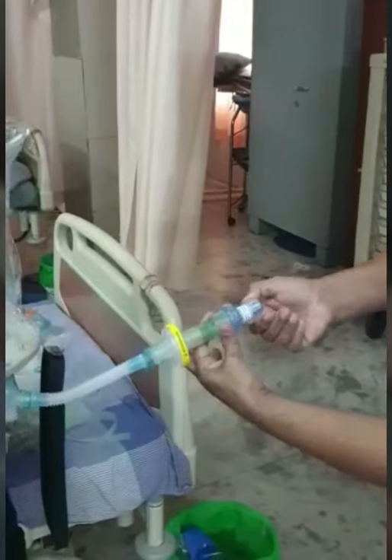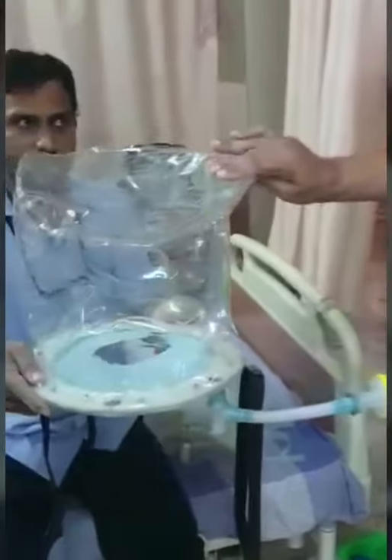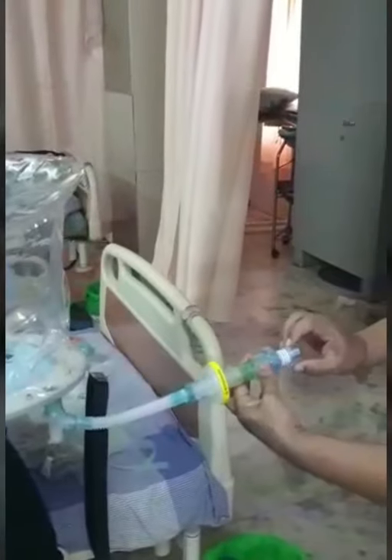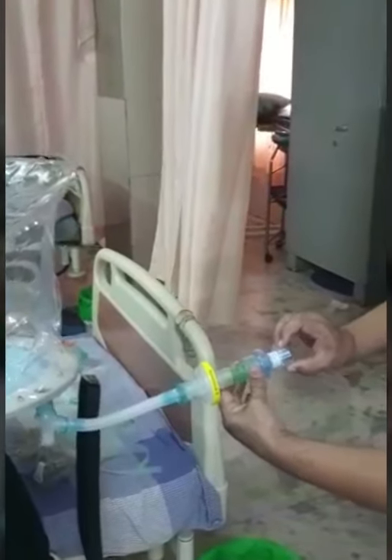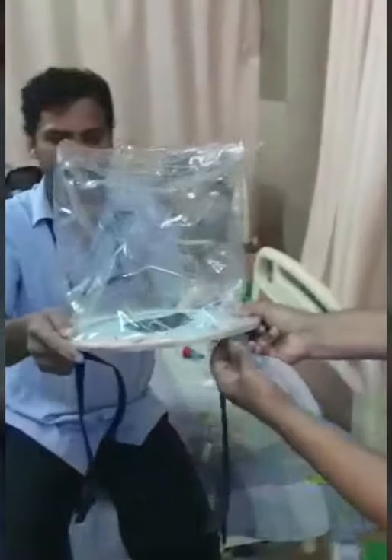This PEEP has to be adjusted to the comfort of the patient. If the patient feels there is too much pressure in the hood, we have to release it. If the patient feels there isn't enough pressure, we can tighten and give more PEEP to the patient. So that takes care of the expired gas.